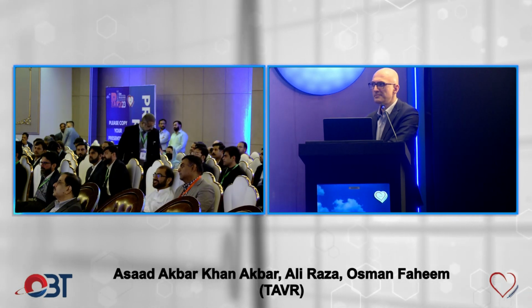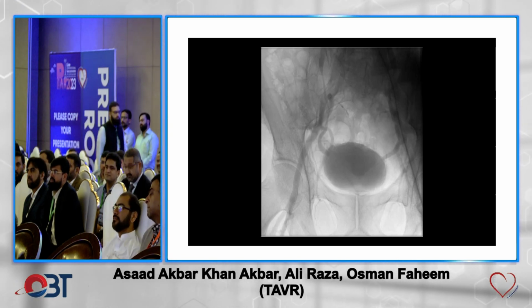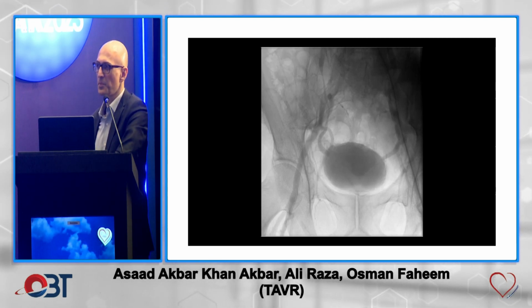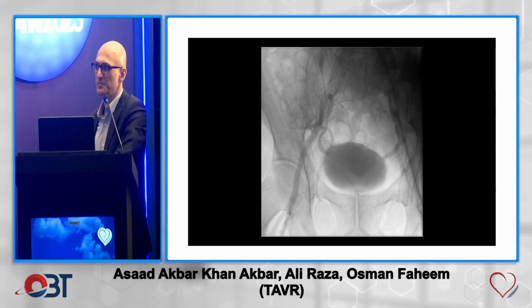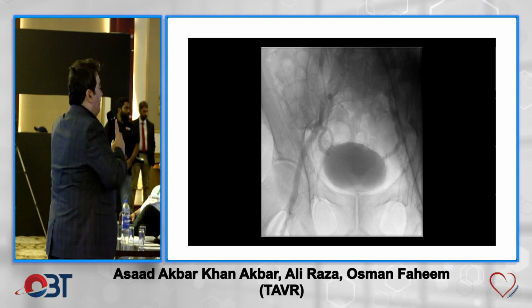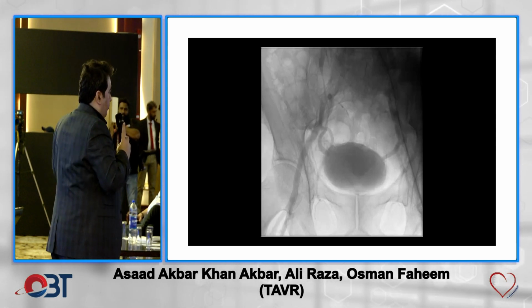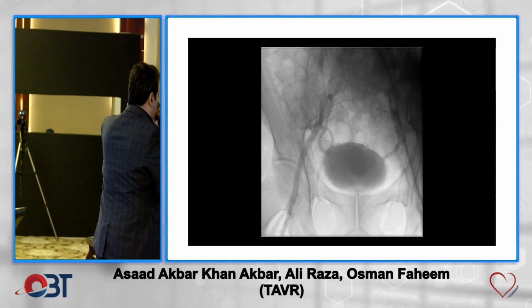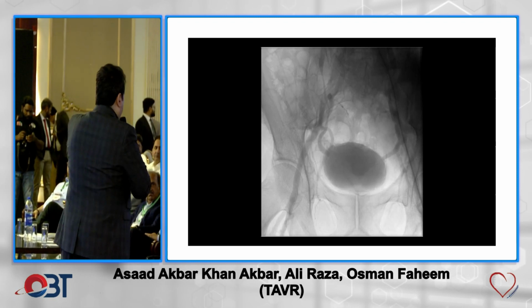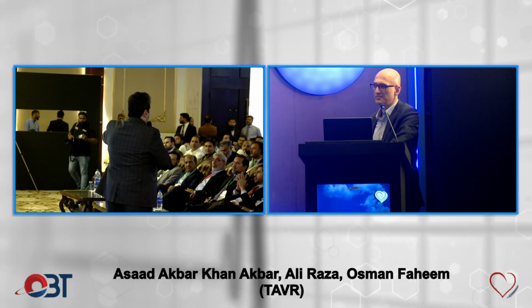Thank you. I will just answer this coplanar view and things. This is music to my ears because I spoke to Nicola Piazza, and where is Salman? I think he's here somewhere. So this is completely, your valve plane is never ever the same as when you're deploying it when you did the CT. The patient was lying like this, everything was different. I do not rely on this at all. I think that this is an illusion which we have created in our brain about it. Go to the two-cusp view, just straight away check it. If you're okay with it, just go with it, check with the parallax, and then later on do it.